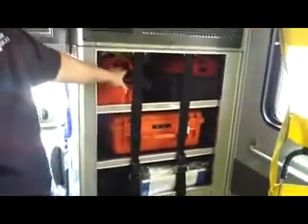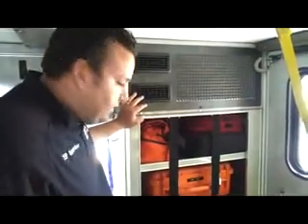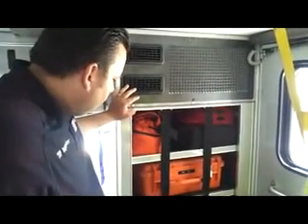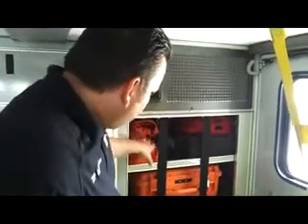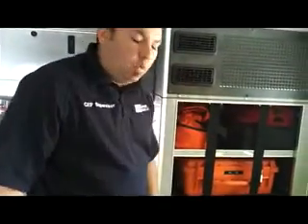Over here is basically our portable equipment. If we end up on a call where we need to take the equipment out of the ambulance, we have our pediatric bag, we have a trauma bag here, and basically the stuff that's in the cabinets here, in this, if we have to go portable.